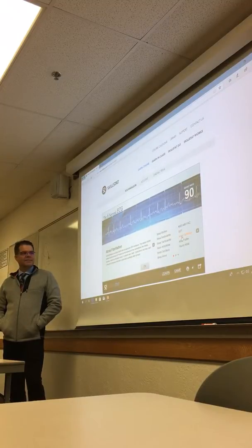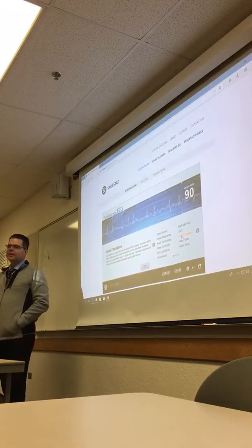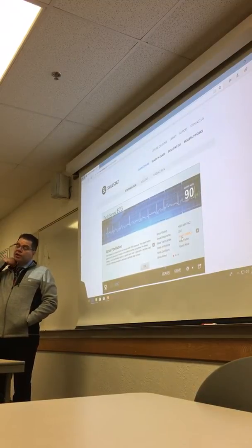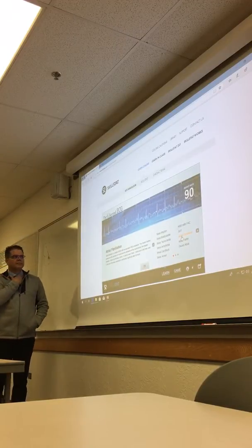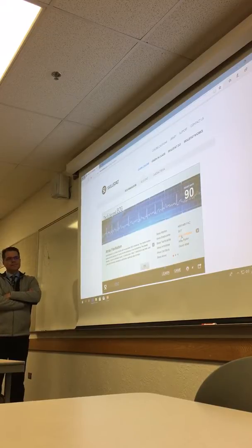She just said junctional won't have a P wave. Because junctional comes from the AV node, so you're not going to see the SA node. I know, do your best with these. But to really get a true reading on that, you have to slow the heart rate down to see these. Again, I'd love to give you another rhythm that looks a little bit better, because that's not a really good one, but they won't have a P wave.